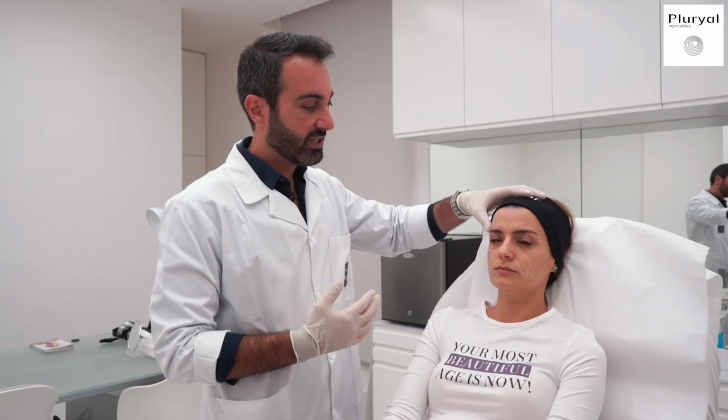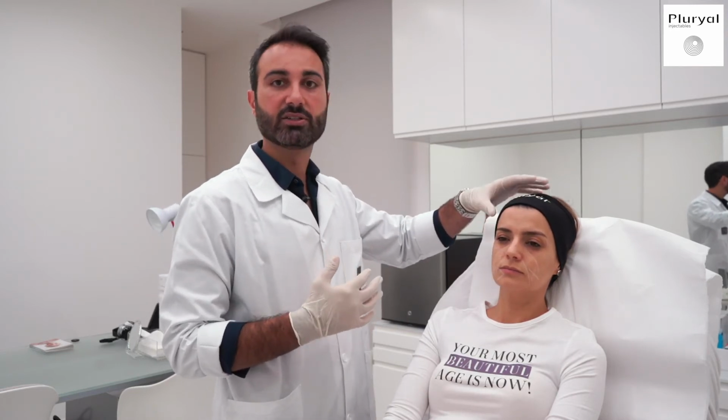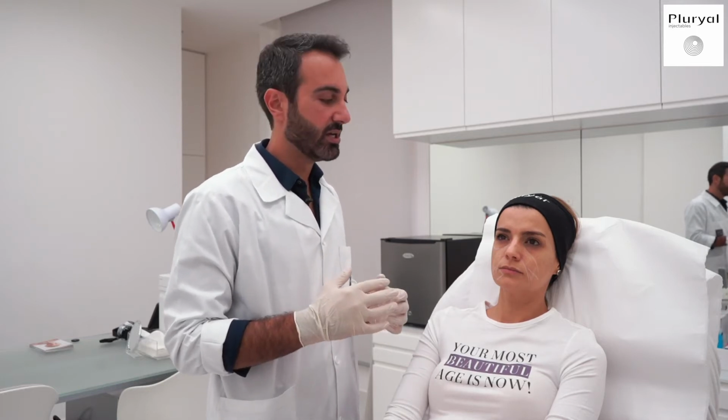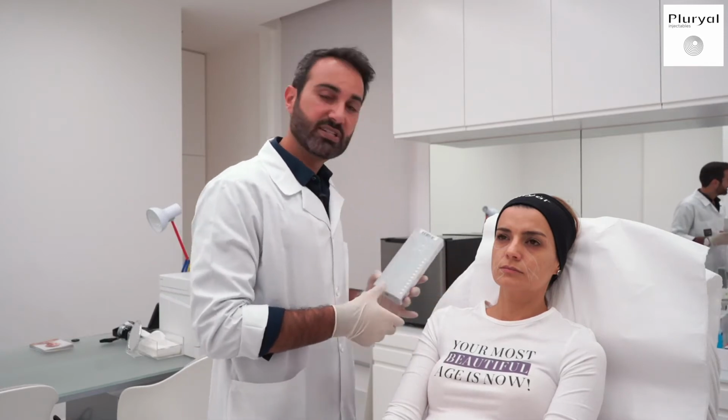The first thing we're going to start with is the temple area. I personally like the gunshot technique, where I do a bolus of filler on the deep periosteum. There's another technique where we can use the cannula and put it superficially subdermally, but I prefer the other technique because it's smooth and it doesn't show the product. For this, I will be using the Pluryal Contour.